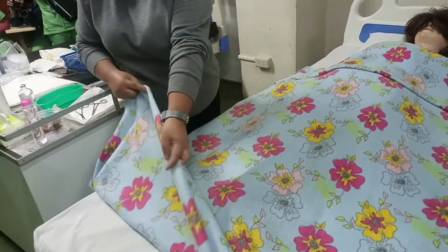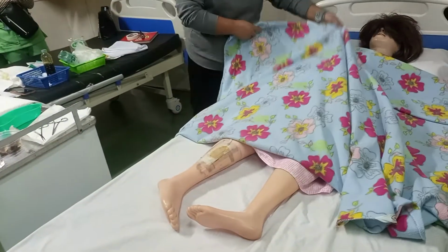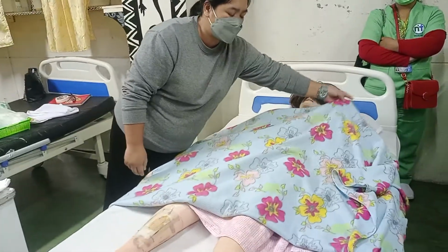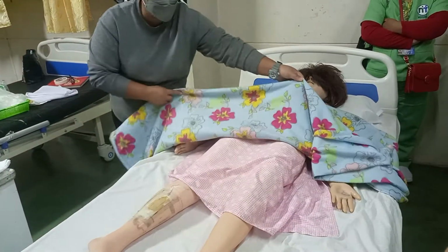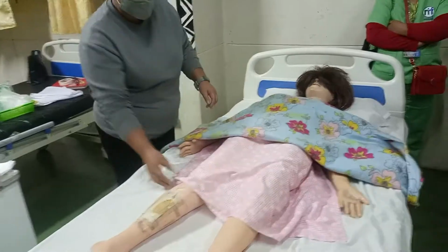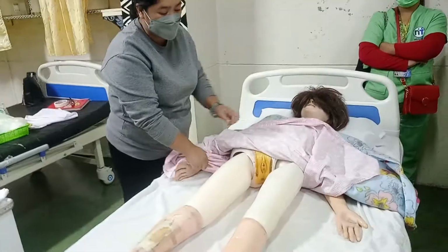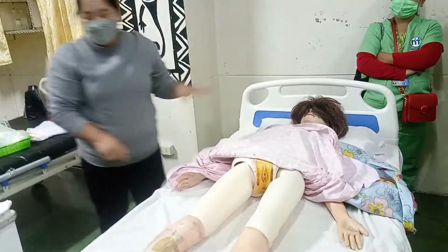Okay. Now that I untap the linens, itataas ko yung linen ni ma'am papunta sa taas para hindi siya lamigin kahit na siya ay mag-dorsal recumbent position. Okay? Yan. Hanggang makita yung sa may perineal area. Alright? So, there you go. Kung nakapanty si ma'am, tanggalin natin ang panty ni ma'am.